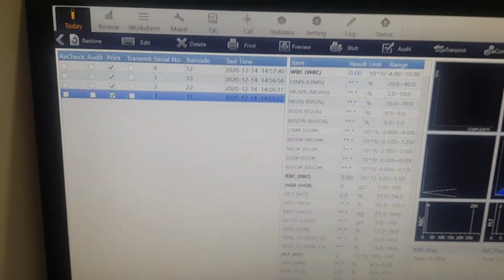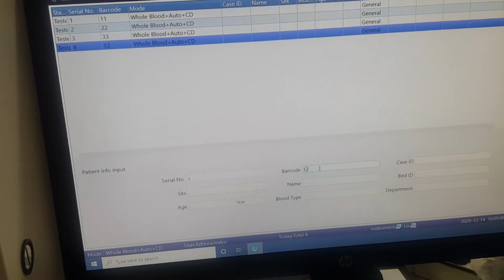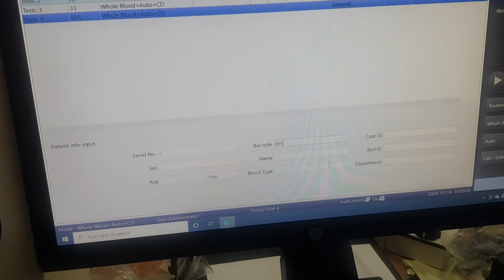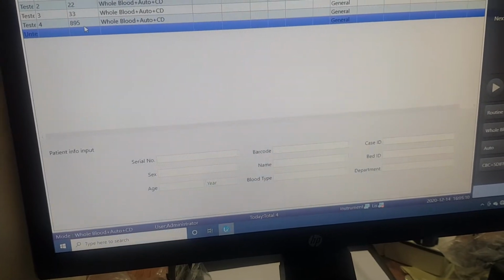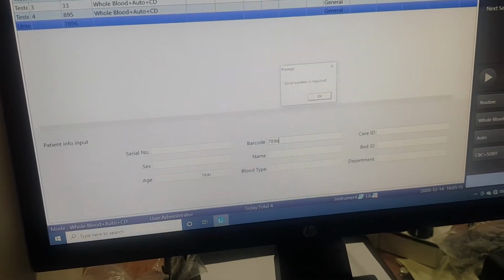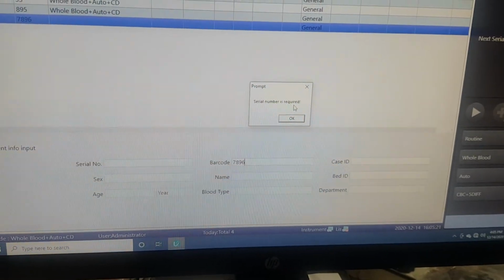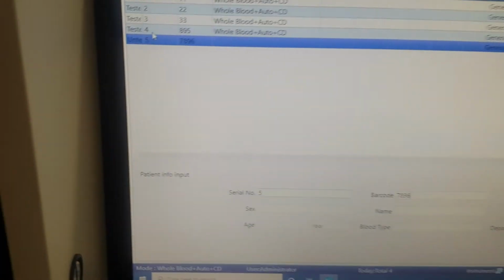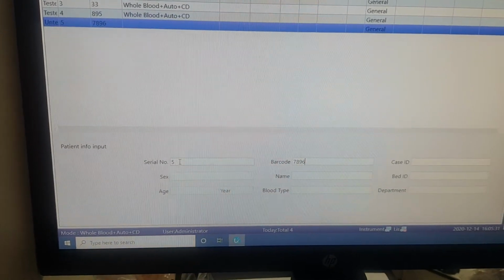Like if we want to create a work list, we go here, we put maybe a new ID like this one, and when we go for next, and again we create new ID, and when we go for next, it is showing the serial number is required. That means serial number is not automatic. So we need to put a serial number here 5, because we already have 4. But when we will work with many samples, we cannot remember the serial number.